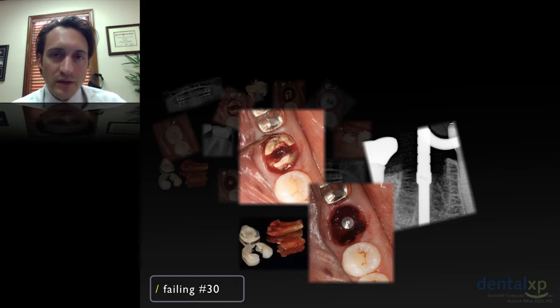And when we really look in the literature, we see that there are even studies that have shown great results with immediate provisionalization of molars. A lot of this is a testament to high insertion torque and great implant design, and to me, predictability lies in minimally invasive procedures when we can, and getting the information ahead of time. Sometimes we can't provide that. If we've got serious buccal plate involvement and we need to reconstruct that, that's maybe a time where we need to step back.